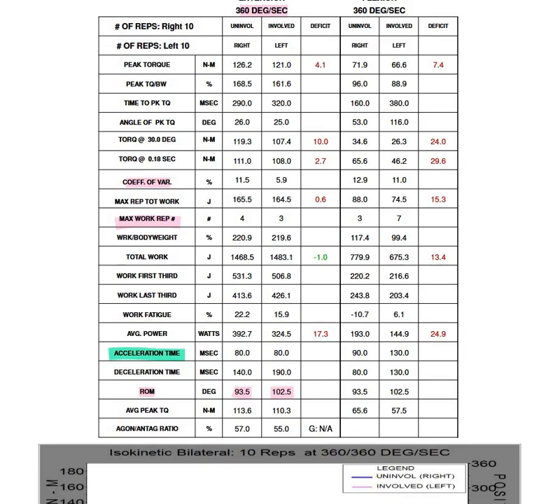It also highlights a rather interesting concept in that the term isokinetics, referring to a constant angular velocity, isn't strictly true. This is a bit of a side note, I suppose, but because you have to accelerate and decelerate, whilst we consider an isokinetic test to be at a constant angular velocity, this period of acceleration and deceleration suggests that that isn't strictly true. Anyway, I digress. So there isn't much in the way of literature out there.